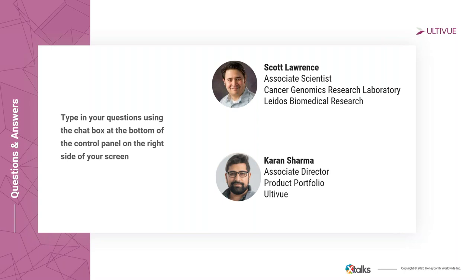Our first question here today is, how does this compare to Codex, which also uses oligo-labeled antibodies? Is the major difference the amplification? Sure. So, Scott, I can take that one, and then if you have any feedback, happy to hear from you as well. So the Codex platform, you're right, it is similar in terms of the fact that they're conjugating unique DNA barcodes to antibodies and then staining it on tissue.